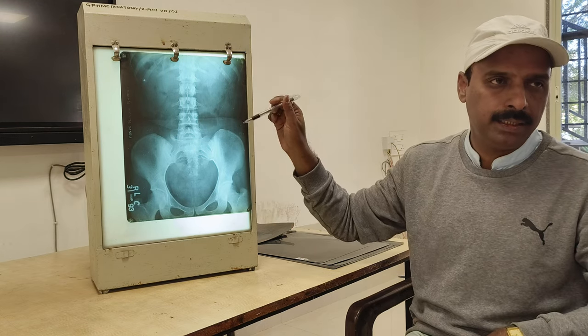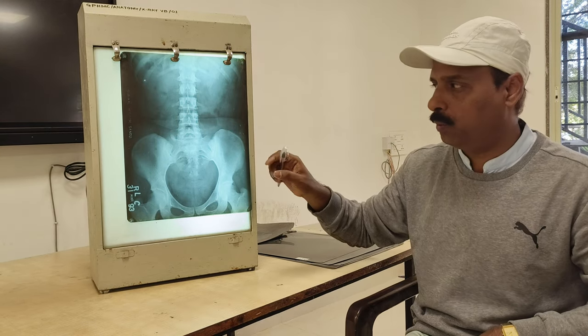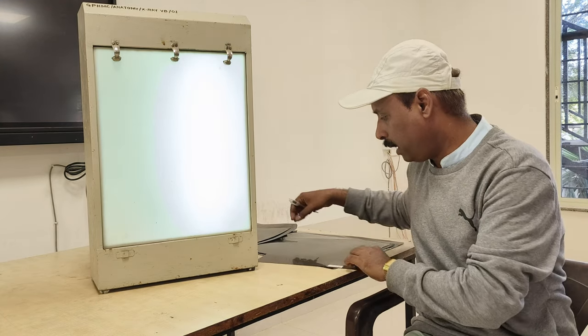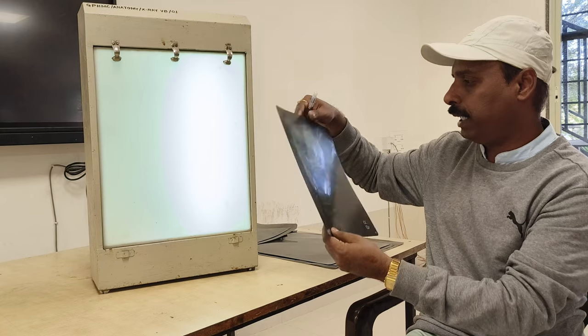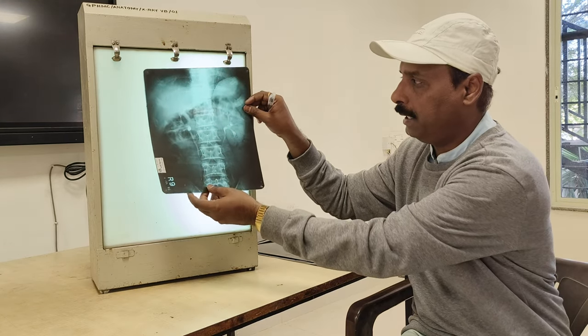So this is what you can remember about the KUB x-ray. So how to read this? This is a plain x-ray; you have to read it like you read other plain x-rays. Then the next variety is one more contrast study, where you are going to get contrast x-rays.